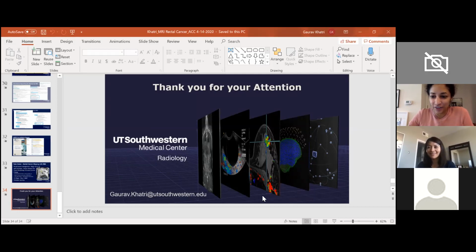She wrote in, if there is a 1 millimeter margin of error for the CRM, would you ever actually dictate a T2 tumor, since the muscularis propria is only about 1 millimeter and you may miss microscopic invasion through the muscularis?